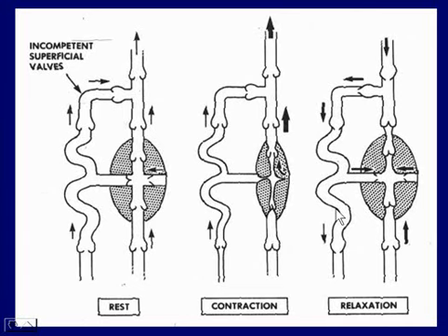Now, when we see patients with varicose veins, what happens is we still take a step, everything heads north to the heart, but when we relax, some blood comes over from the arterial side, but some blood falls back down because now we have incompetent valves along the saphenofemoral junction and within the superficial system.